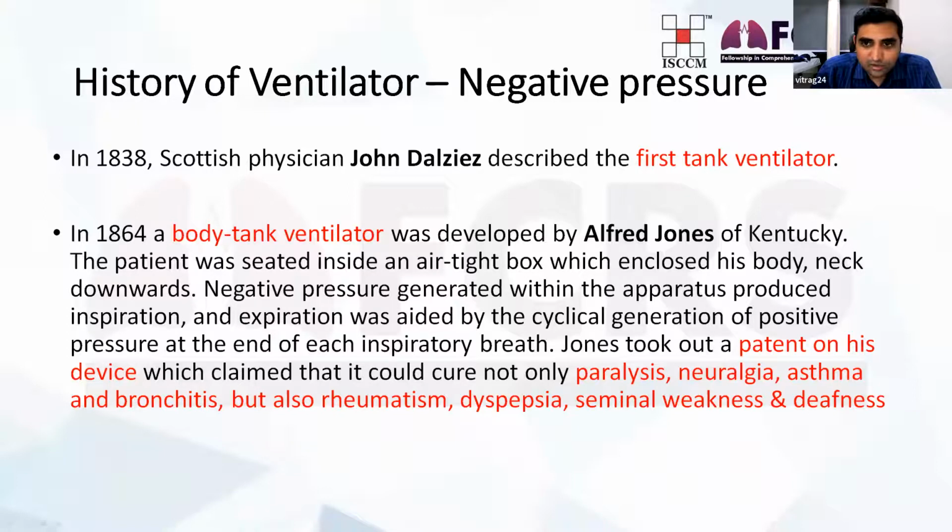And Alfred Jones took a patent on his device, the body tank ventilator, and he claimed that it could cure not only paralysis, neuralgia, asthma, and bronchitis, but it also cured rheumatism, dyspepsia, seminal weakness, and deafness.